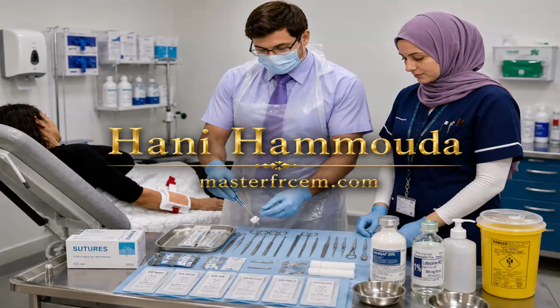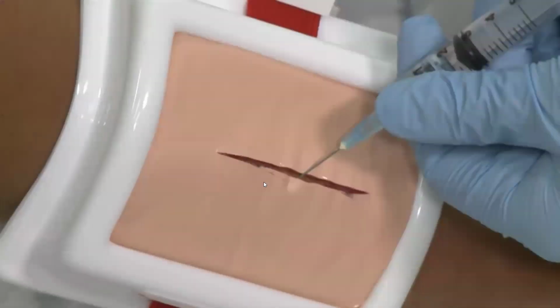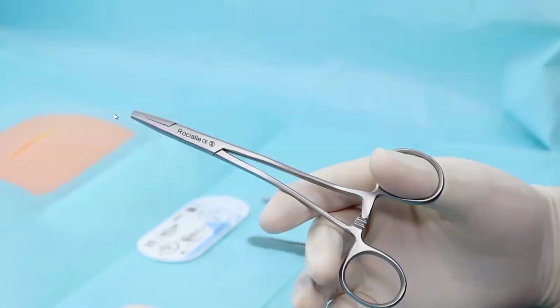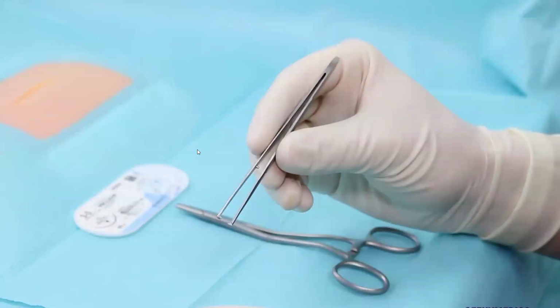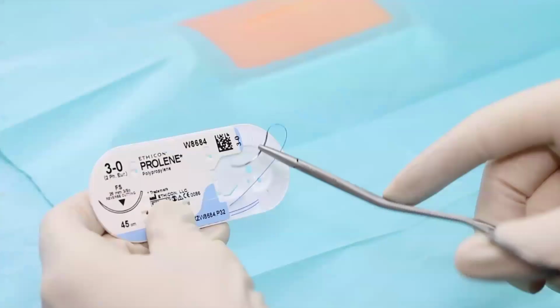You should do sutures. If you do 2 sutures, you will get 10 out of 10. If you do not do sutures, maximum 2 or 3 marks. Clear? Your task is sutures. Already you cleaned the area, already you infiltrated, then hold the needle holder by dominant hand, the forceps by non-dominant hand, and ask the nurse to hold the scissor. Clear? You will hold the needle from the lateral third. Don't touch the needle. You can touch the thread, no problem.